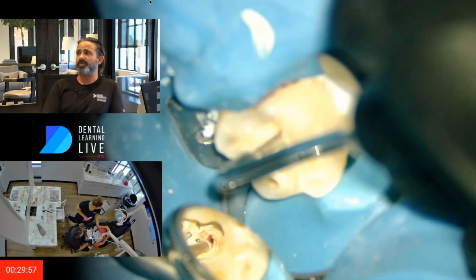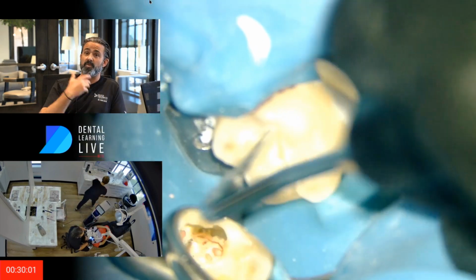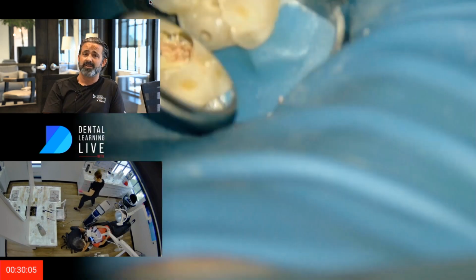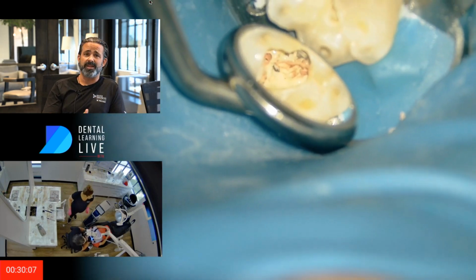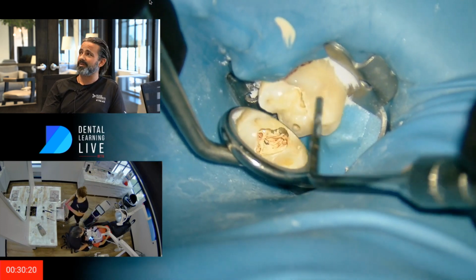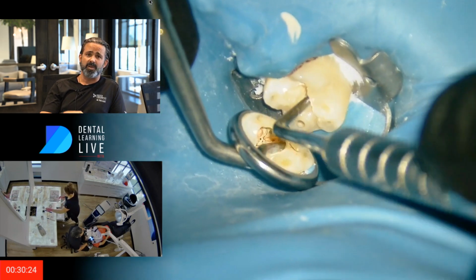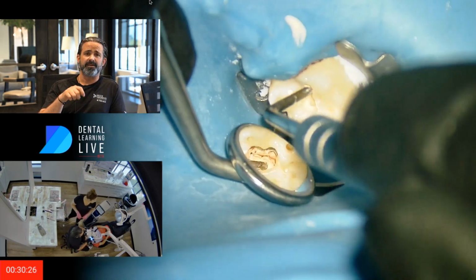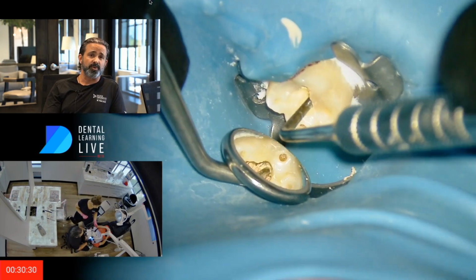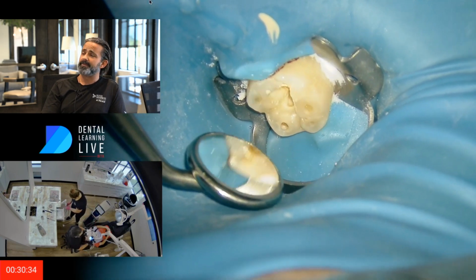I actually will use a burr to kind of polish the floor. I always feel like if I wasn't doing a permanent filling, I'm judged by the way that entry point looks. So I'm a fan of really making that nice for the general dentist. That's what I get judged by when they look at a tooth, after all. And then I'll clean up the sealer with just a bendy brush. It's yellow, and I use isopropyl alcohol. I use high proof, it's 90 proof, and to me that matters.